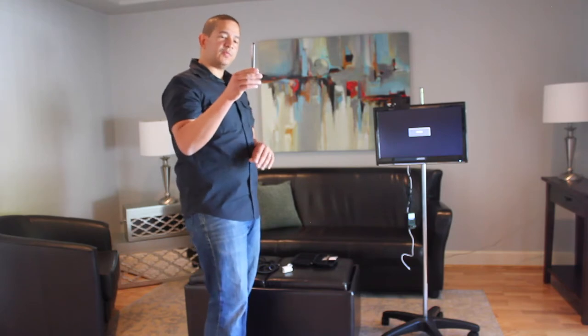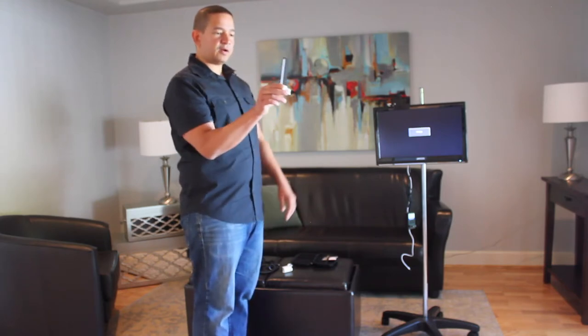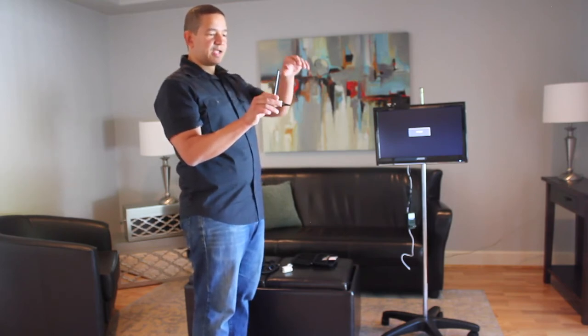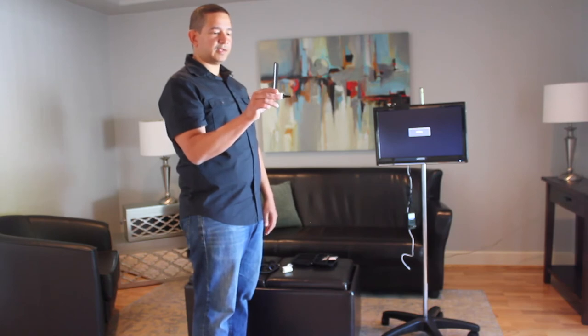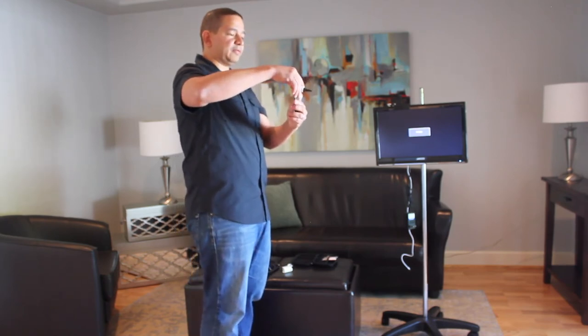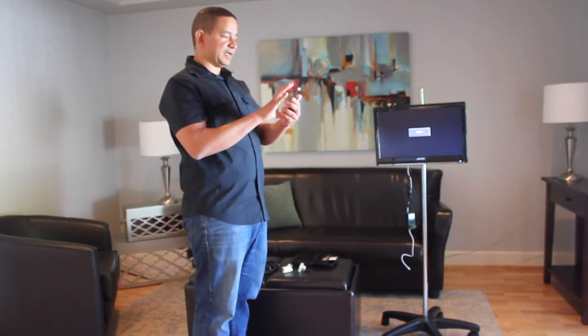When you use this as an otoscope, you want to hold it upside down. This gives you the best control and also allows you to take a look at what you're seeing locally. And that's how you turn your handheld device into an otoscope. To revert it from an otoscope, just simply pull the attachment off and put it aside for next time.